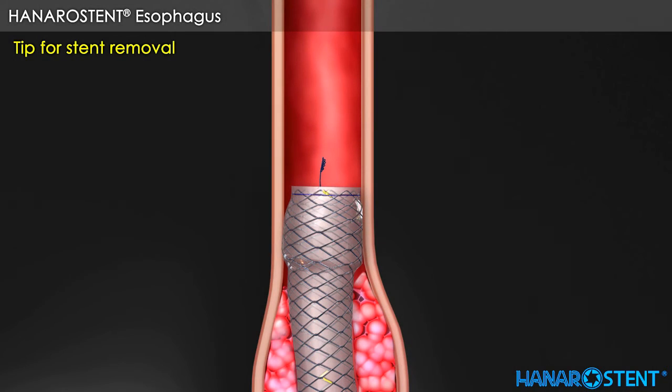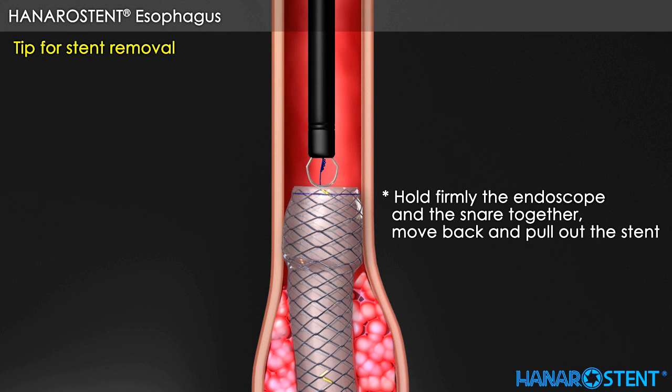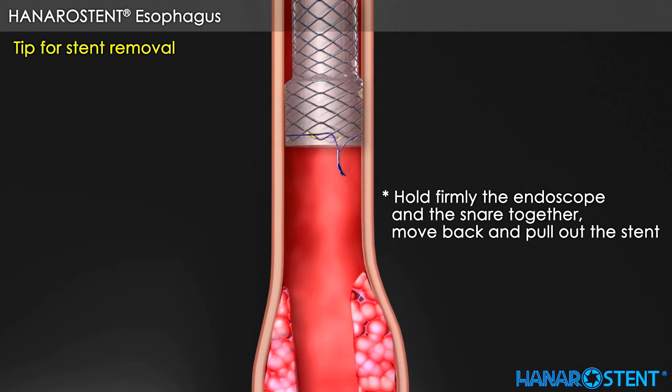Here are tips for stent removal. Using a snare. First, close the upper part of the stent by catching and pulling the lasso. Second, pull out the snare inside the working channel. Third, hold firmly the endoscope and the snare together. Move back and pull out the stent.